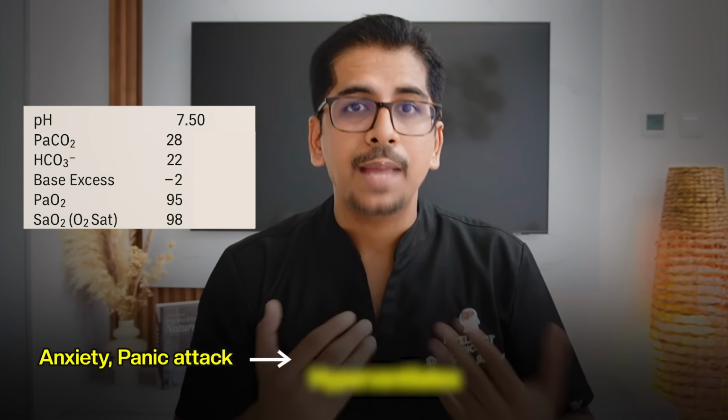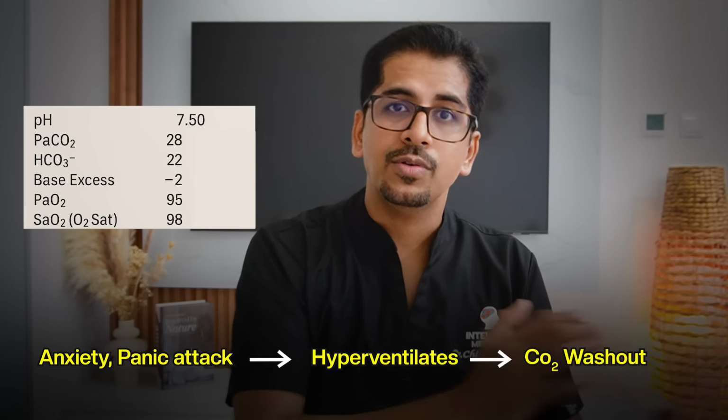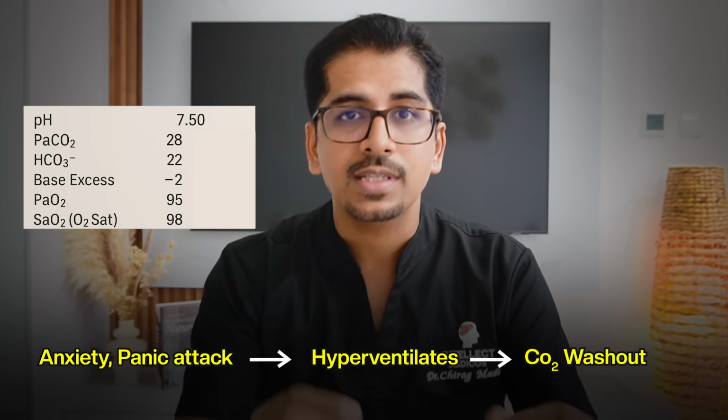The history says the patient presented with anxiety, with palpitation, right? With that presentation of panic attack or anxiety, the patient hyperventilates and there is a CO2 washout, as in this case. PaCO2 has come down to 28. Hence, it's an acute scenario.